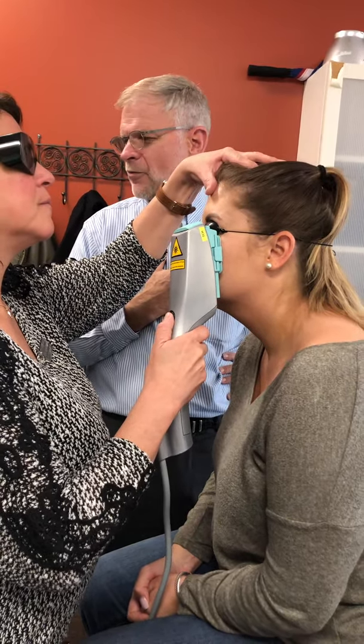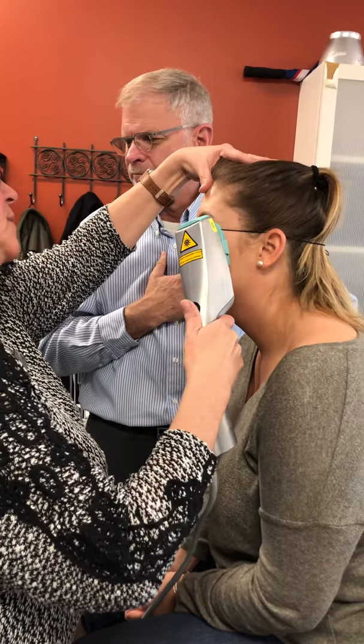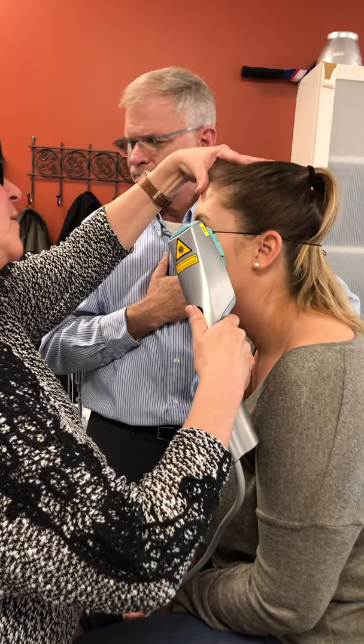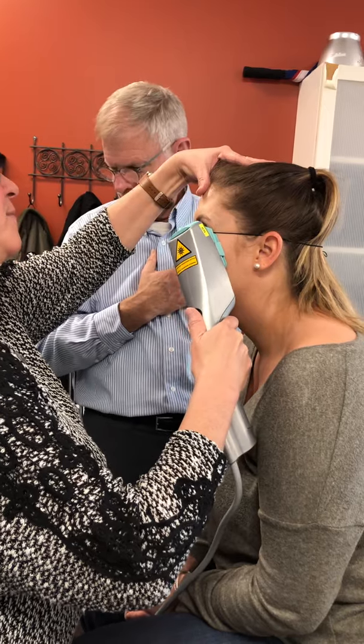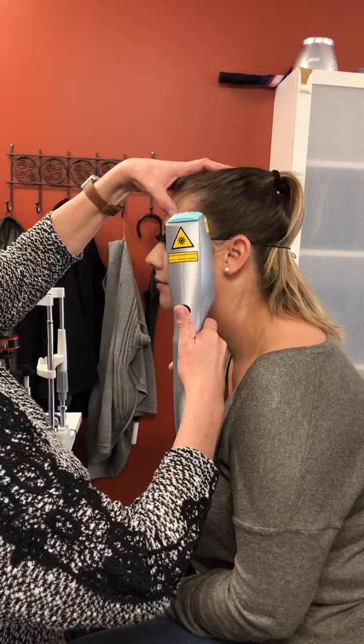Usually what I'll do is tell them 3, 2, 1, and push the button, that way they know it's coming. And that's it. All of this out here, if it's kind of overlapping, that's the biggest mistake you can make doing it. We wanted to line up pretty much with the brown.